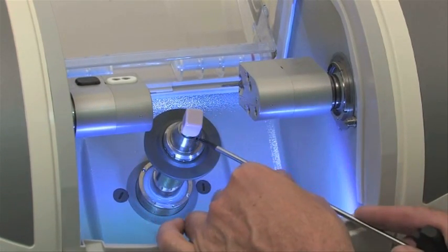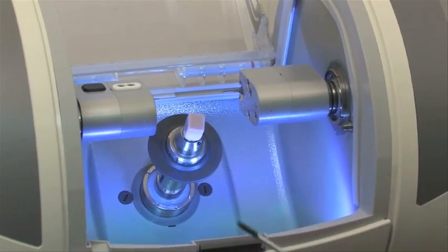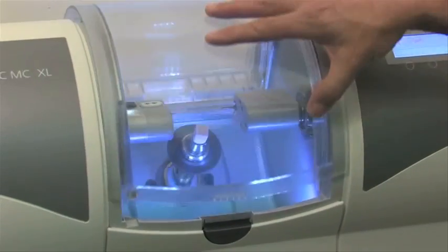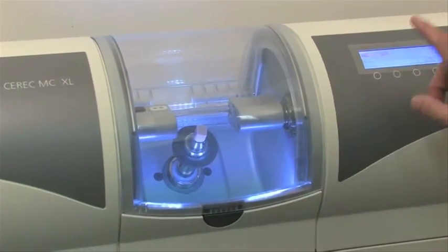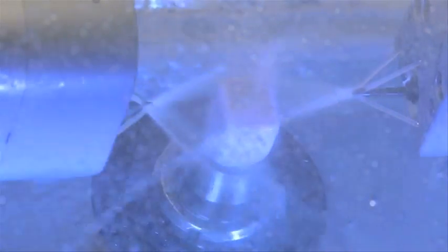The Emax porcelain blue block is installed. Many preliminary measurements are made by the two opposing milling burrs which will cut out the newly created restoration from the center of the block. Water is used as a cooling agent to aid the precision cutting.